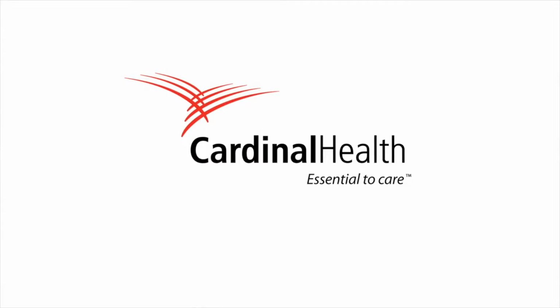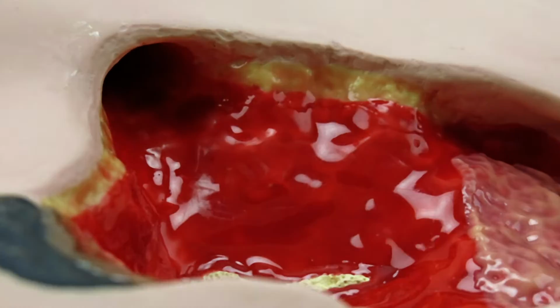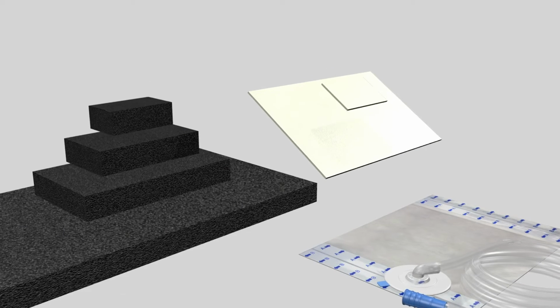Negative pressure wound therapy is helpful for wounds that come in all shapes, sizes, and depths. Dressing even challenging wounds can be done if you follow a few basic principles. First, assess the wound and obtain the appropriate dressing supplies.